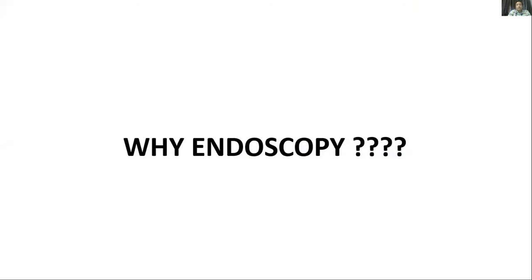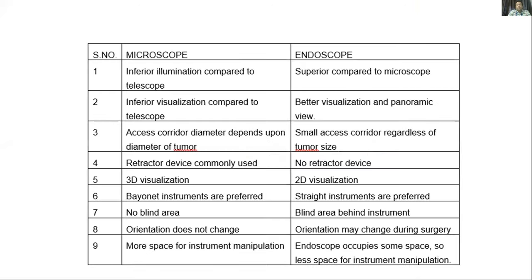We specifically used endoscopy in this patient because the endoscope provides better illumination, better visualisation, and a panoramic view. It requires only a small access corridor regardless of tumour size, whereas in microscopy the access corridor depends on tumour size. No retractor device was needed, whereas retractors are usually required with microscopy. However, microscopy has advantages too: there is no blind area behind instruments as with endoscopy, orientation is stable, and the endoscopic view can be obstructed by instruments in the small working space.